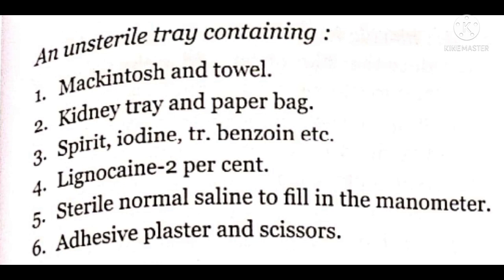An unsterile tray containing: 1. Mackintosh and towel. 2. Kidney tray and paper bag. 3. Spirit, iodine, tincture benzoin etc. 4. Lignocaine 2%. 5. Sterile normal saline to fill in the manometer. 6. Adhesive plaster and scissors.